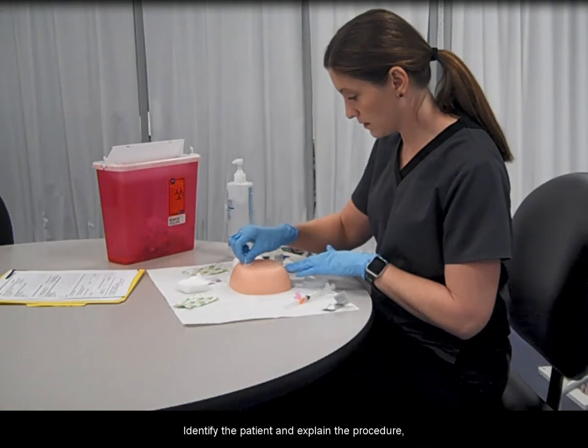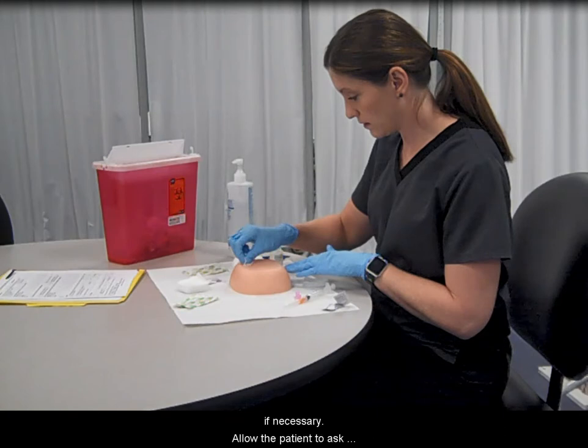Identify the patient and explain the procedure using language the patient understands. Ask the patient to remove clothes if necessary. Allow the patient to ask questions and respond to the patient as appropriate.